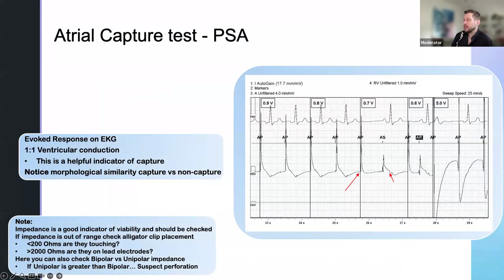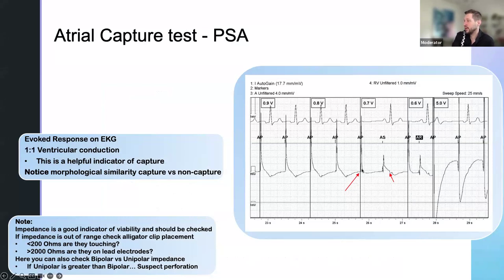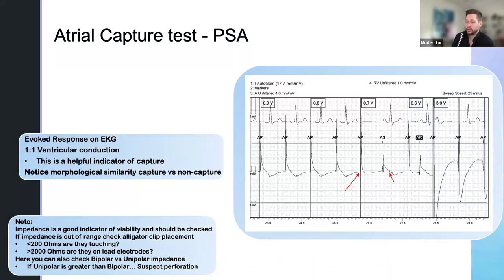Looking at the deep dive on the atrial capture test: clear one-to-one is a helpful indicator of capture. Morphologically, capture versus non-capture look very similar. We didn't capture here, and we did here — you could argue it's a little bit different morphology, but very, very similar. If you're just going off the spike, you'll be tricked. Always make sure to look for other indicators, because I've seen it where people have set thresholds much lower and set output sub-threshold as a result.